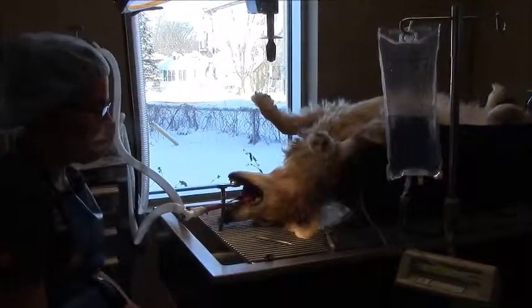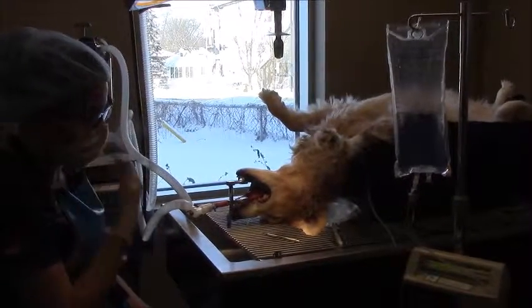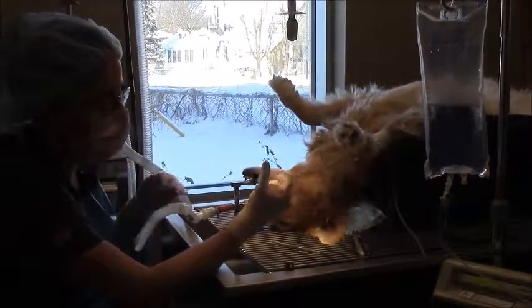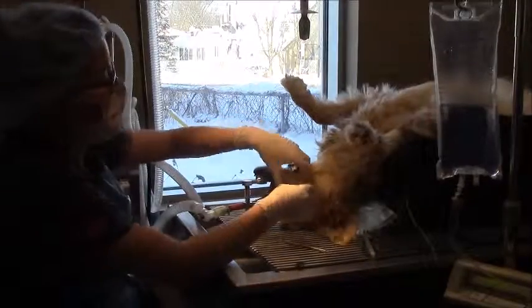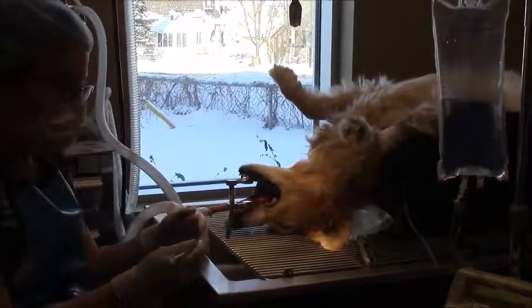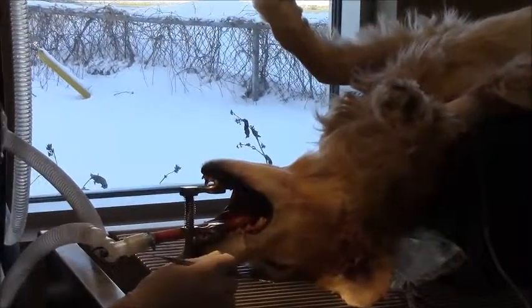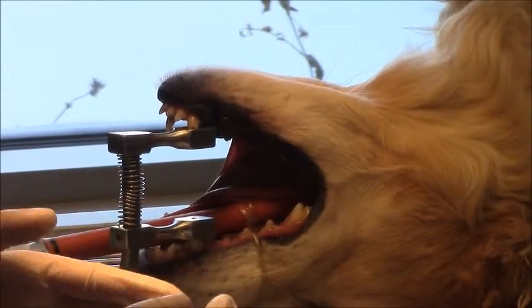Hi, my name is Tanya, and I'm a registered RVT. Today I'll be performing the dental procedure on Ruby. Ruby first needs a dental exam to evaluate how the teeth are. From there, I will check if there are any gingival pockets, which is a gum pocket. A gum pocket is usually evidence of something going on deeper inside the root. I will then inform Dr. Viranowski, and he will make the final decision if that tooth needs to be extracted or if any further treatment needs to be done.